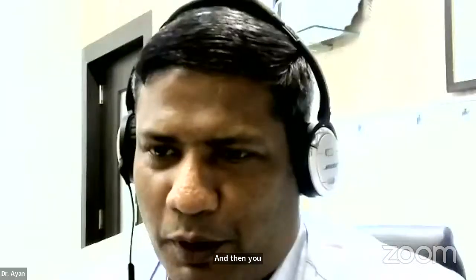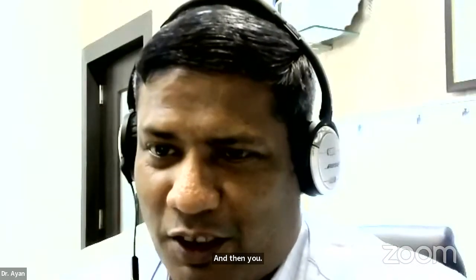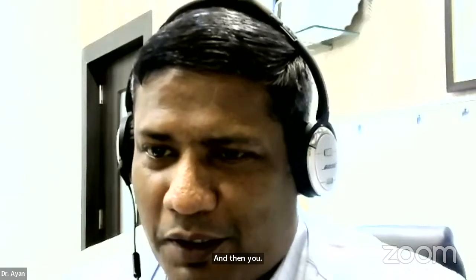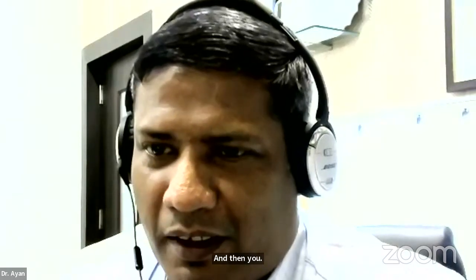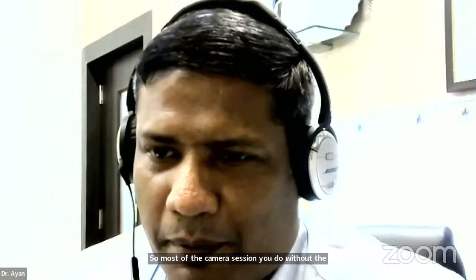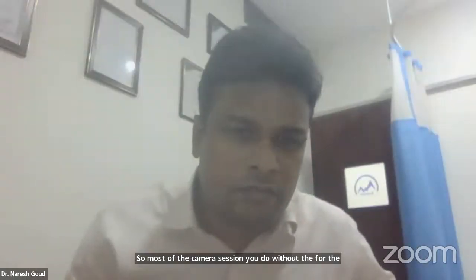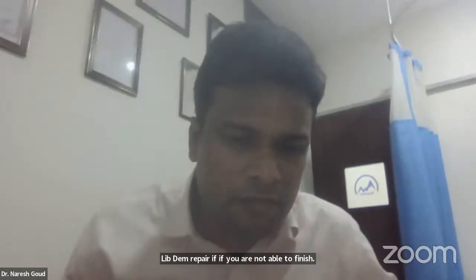For people who are starting hip arthroscopy, that turns out to be important, because if you are trying to do something meaningful like a labral repair or a cam resection, most of the cam resection you do without traction, but for the labrum repair, if you are not able to finish, that's a good take home point today.